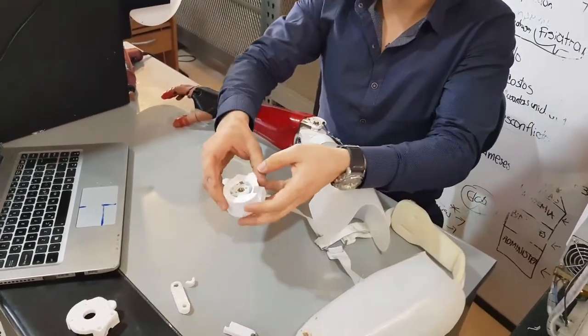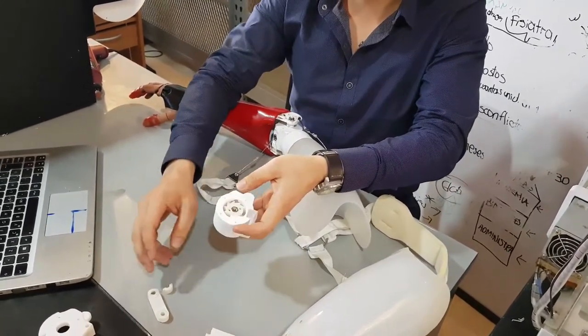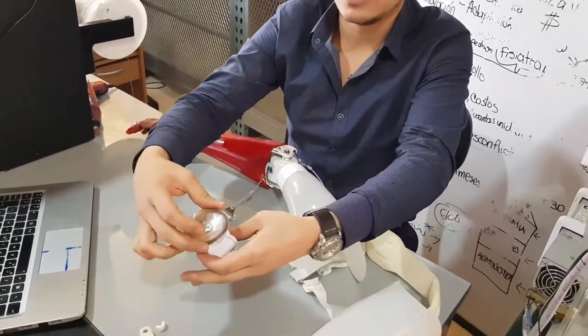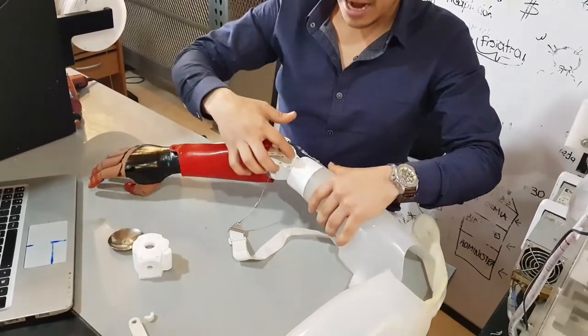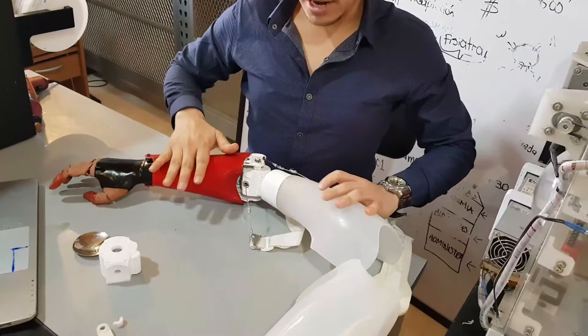It includes a 3D printed elbow for a short stump with a multi-axial connector. This is the multi-axial connector right here between the forearm and the socket.